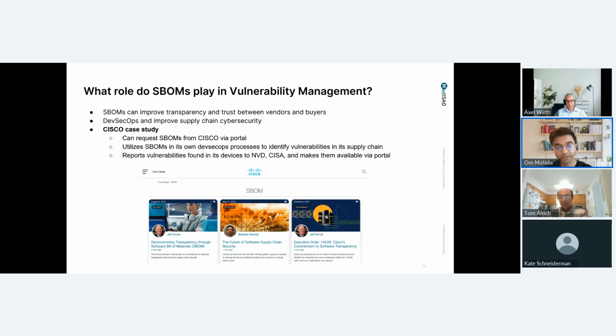So what role do SBOMs play in vulnerability management? SBOMs came into play a few years ago, and one of the biggest pillars of SBOMs is improving transparency and trust between vendors and buyers. SBOMs aren't just a concept in the medtech space. They're something in the general software and IT industry that has become more and more popular through regulatory bodies like the FDA, but also the executive branch pushing for SBOM adoption in government contracts.